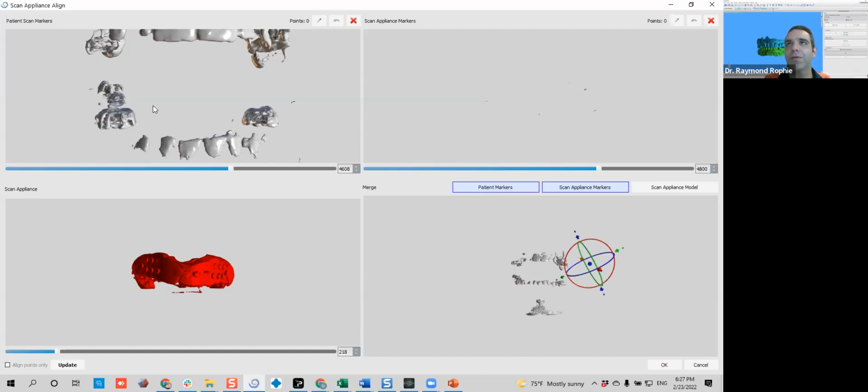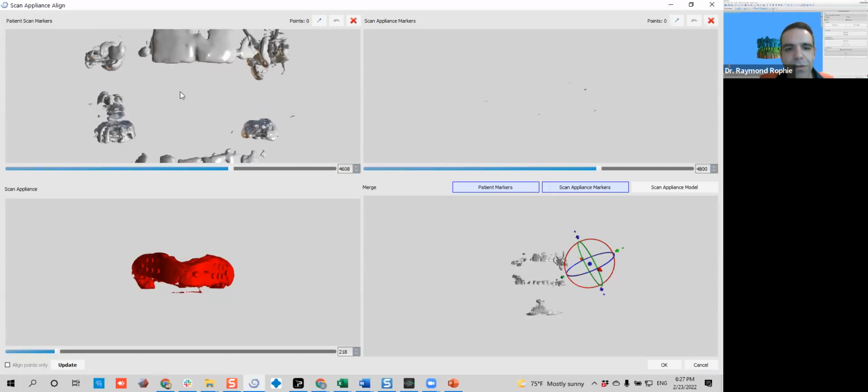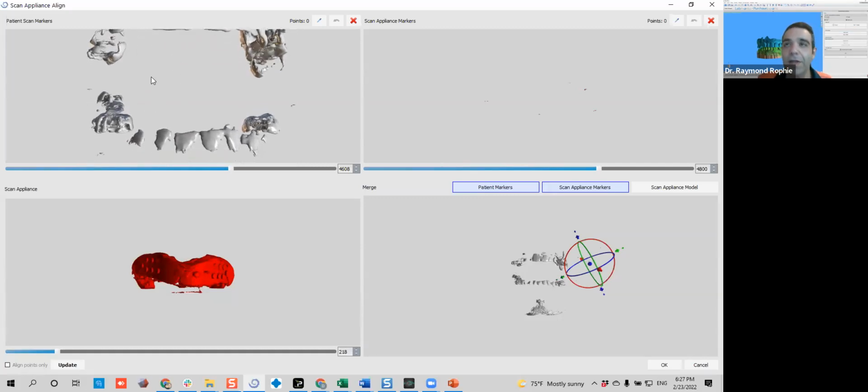Maybe, Michael, we can do a webinar about the restorations only later on. It will be really good. I'll be happy to do it. Okay, so are there any other questions now, or can I go on?